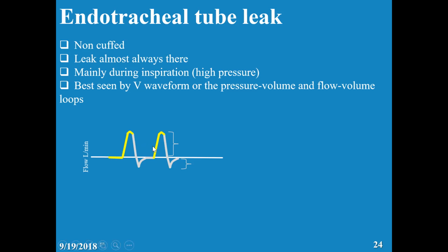So if the in is more than the out, where is the remaining of the in? Where is the remaining going? It is lost from the ventilator. So there should be a leak. Yeah. Is that clear? Yes.